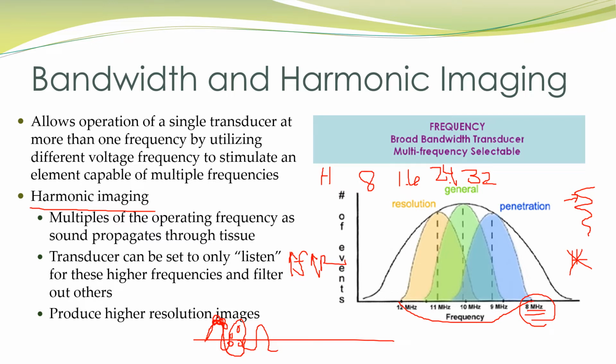Now, other times you might be scanning something like a cirrhotic liver or something that's very dense and difficult to penetrate.